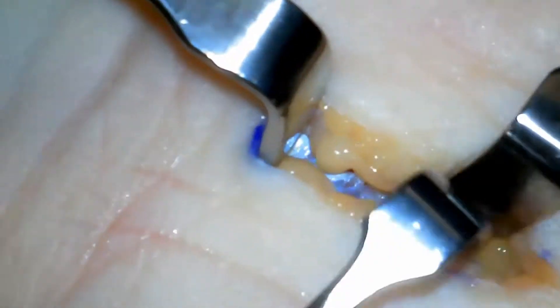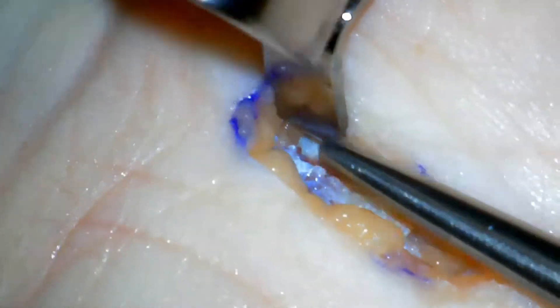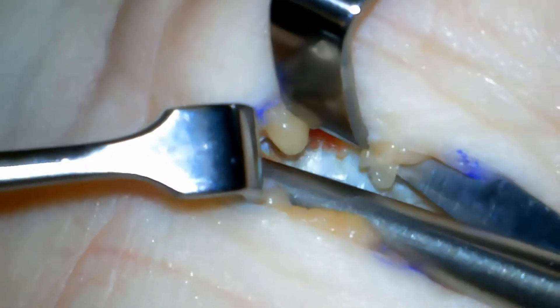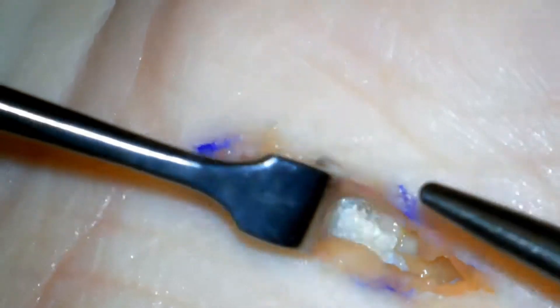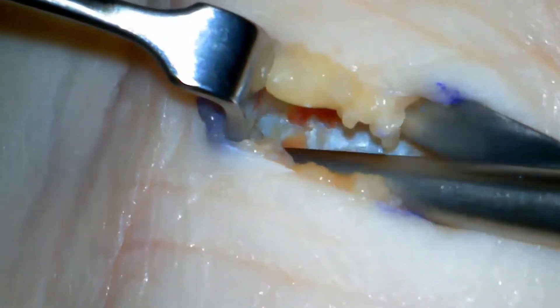This is now the leading edge of the transverse carpal ligament which has been identified. The larger scissors are used to bluntly dissect and remove some of that wispy fibrous tissue overlying the heel of the hand.